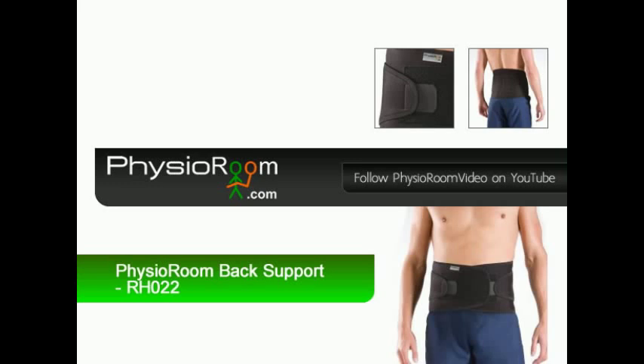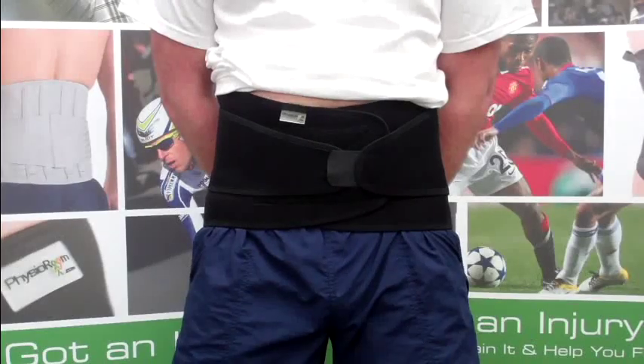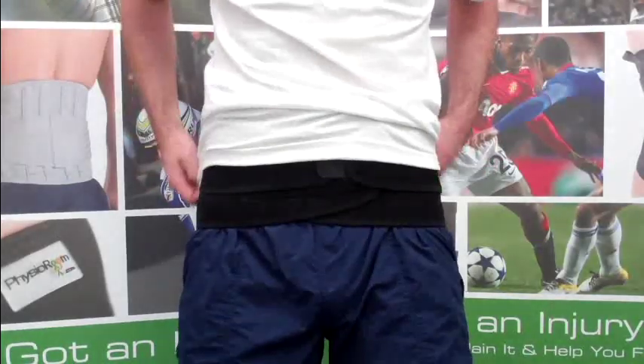The PhysioRoom.com Elite Back Support is a top quality back aid which can be used during work and sports activities. It can be worn beneath everyday clothing to give support, warmth and back pain relief.